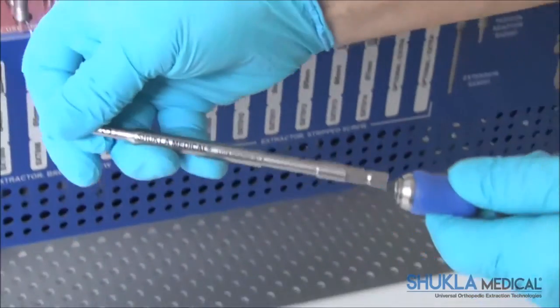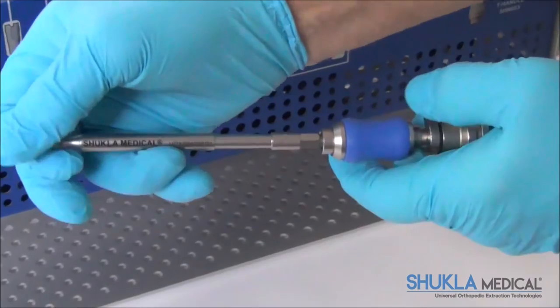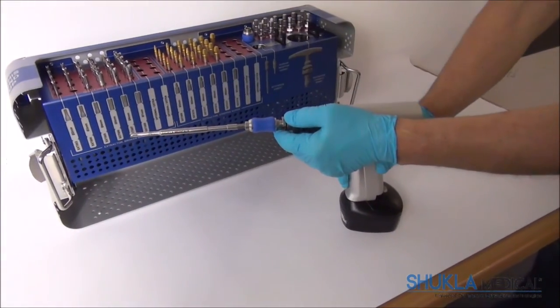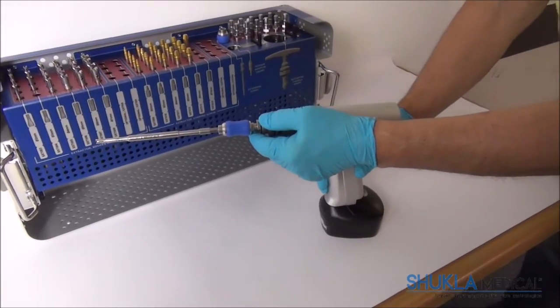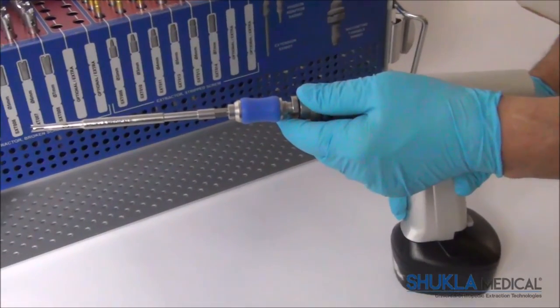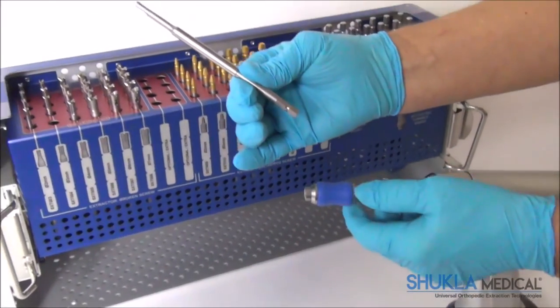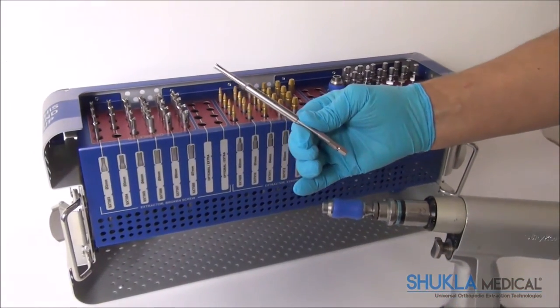After the broken screw extractor is connected to the driver, it is turned in a counterclockwise direction over the broken screw until the threads inside the extractor engage and lock onto the screw. Then, the screw is removed by continuing to turn the extractor in a counterclockwise direction.